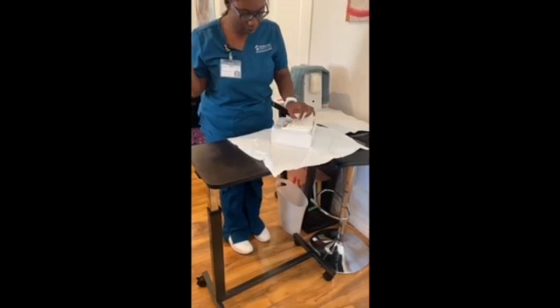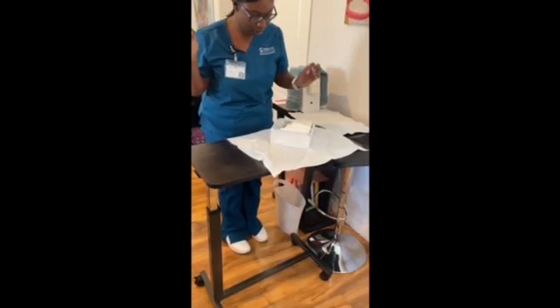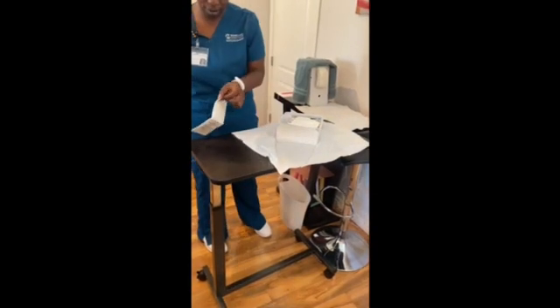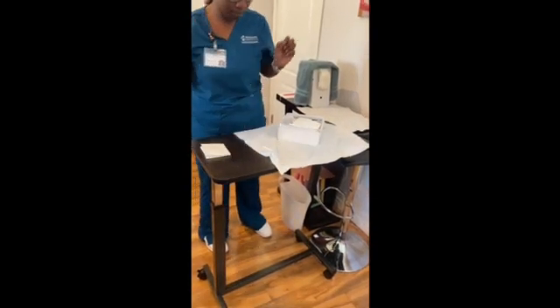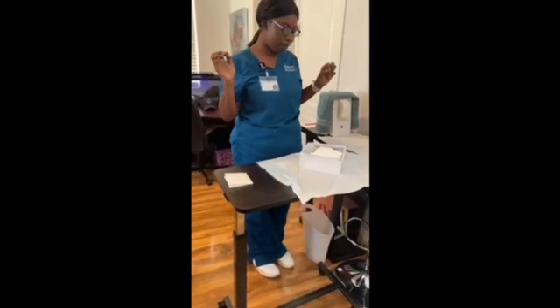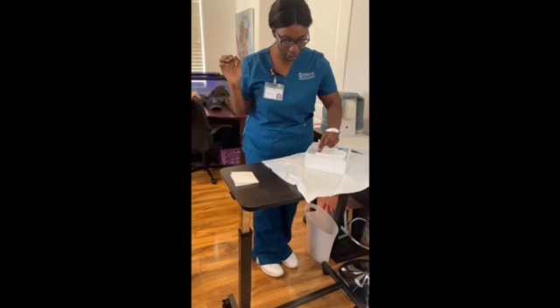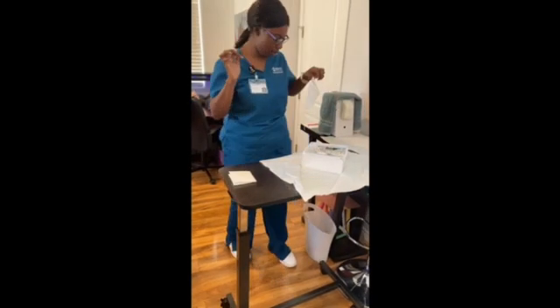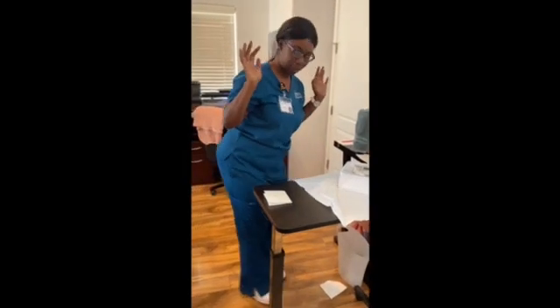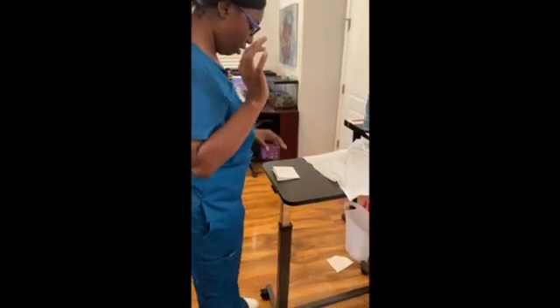The fenestrated drape is not needed for this video. These are the gloves. If we were going to use the fenestrated drape, we would place it over the patient's labia, the opening area. Okay, so now I'm going to put on gloves.